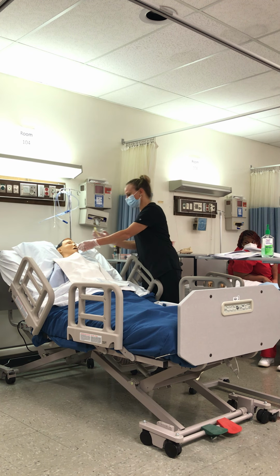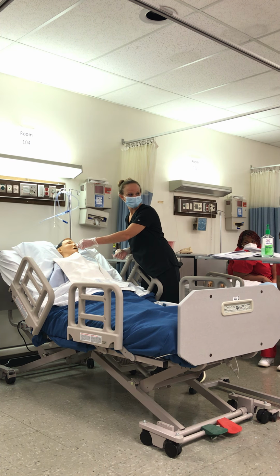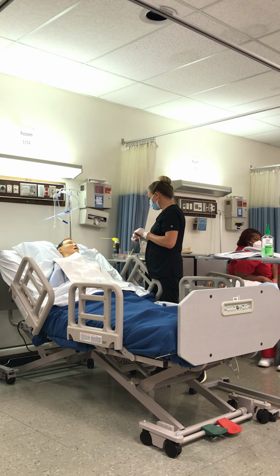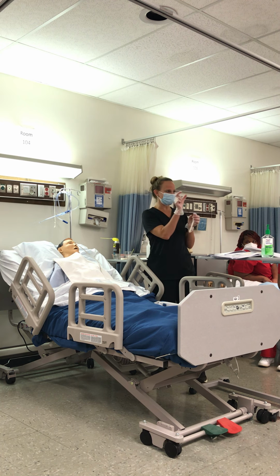Okay, now I'm at my mark. Now, what do I do with this tube? Take it. Where's my tape? Right here? What do I do with this tube while I get my tape? What's gonna happen if I let go? He's gonna fall out. It's probably gonna be pushed out, possibly. So you do wanna have your tape pulled or torn beforehand. This is not ideally the tape to use. Ideally, it's gonna be a lot wider.